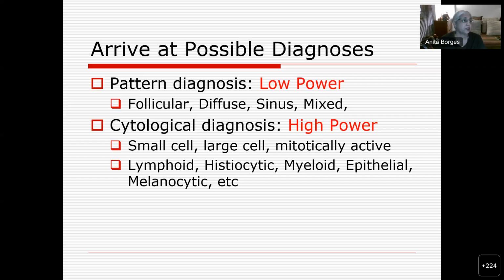And I say Reed-Sternberg cells because you are going to see a lot of small lymphocytes in a case of Hodgkin lymphoma. So just do that, just see. And of course, in between, there are intermediate sized lymphocytes. The intermediate lymphocytes are not truly intermediate between small and large. They tend to be more small as compared to what we call large cells.